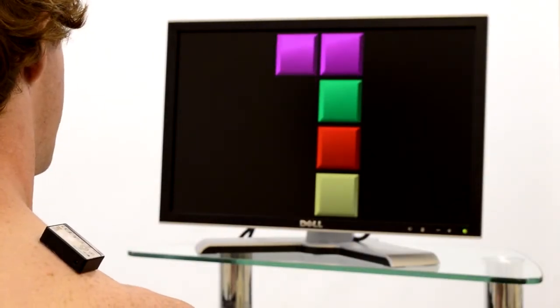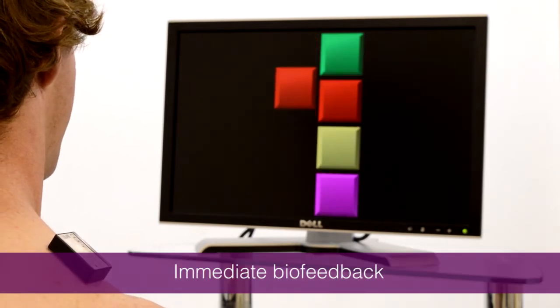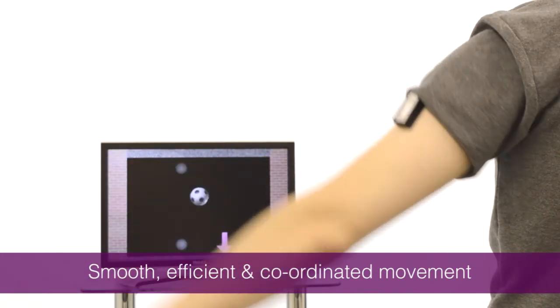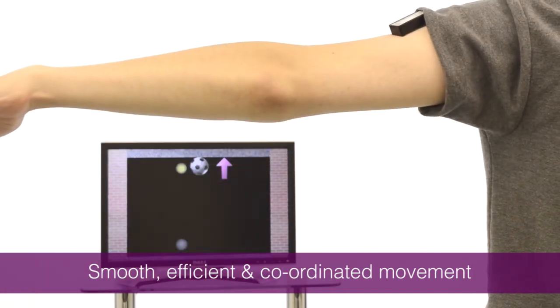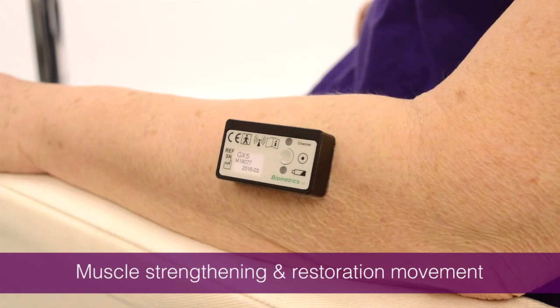MyoX provides immediate biofeedback through the visual movement of objects on the screen, maximising the patient's motivation to exercise. To succeed in the game, the patient is focusing effort on a smooth, efficient and coordinated movement rather than recruiting possible compensatory ones. Muscle strengthening and restoration of normal movement patterns is encouraged.